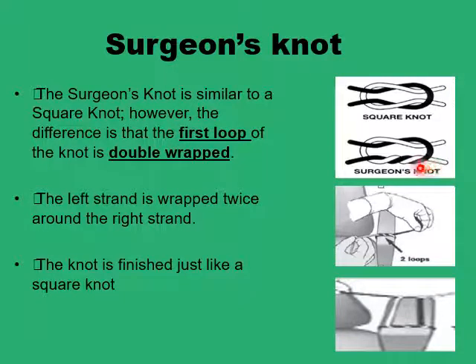You can change the number of the wrapping in the first half reef or the second half reef, or have multiple half reefs, 2 or 3, like when you're tying synthetic material, for example. The basic idea remains the same. You are forming multiple half reef knots, whether by single wrapping or double wrapping, and then you could develop different types of knots.